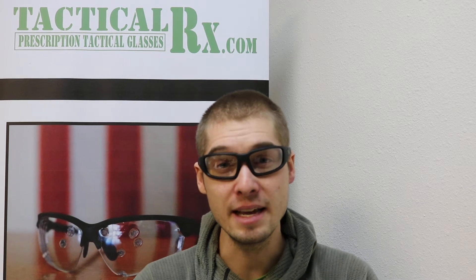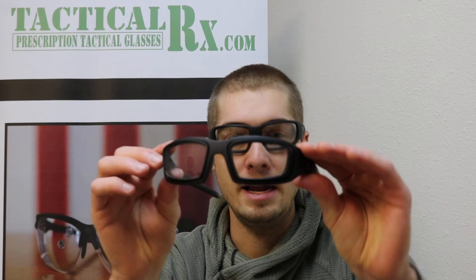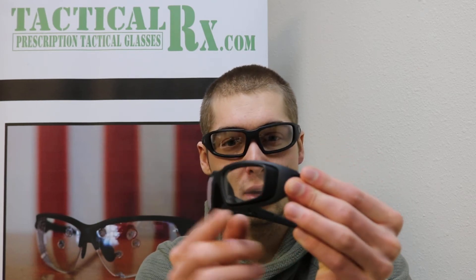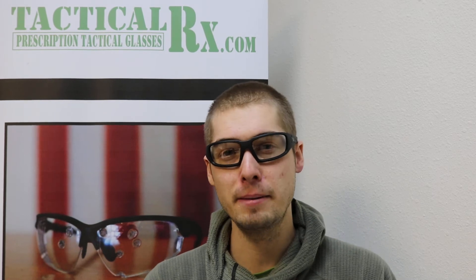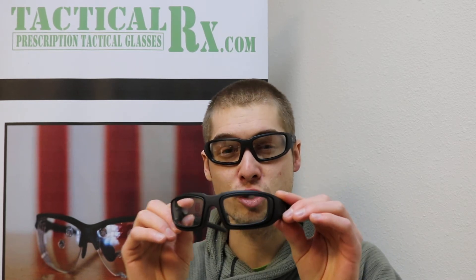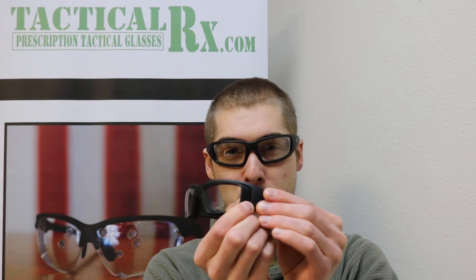Another thing about this frame that's great is this guy right here is the same frame, just with these strong prescription adapters. So what this does is allow us to put a very strong prescription with very thick lenses into this curved frame. We can accommodate mild to light prescriptions directly into the lenses for this frame, but if you have an extra strong prescription, then we can accommodate you most likely with these adapter pieces.